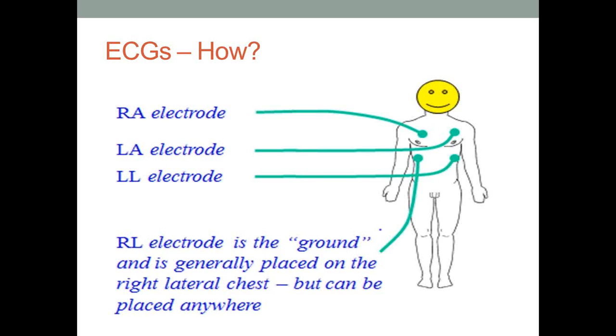So here's a little bit of the how behind recording an ECG. So typically, and you'll notice this hopefully on your cardiac monitors in the lab, you have 4 wires attached to the cardiac monitor, and each of them indicates where to put the probe, so where to put the actual electrode, the sticky part, on the patient. You'll see RA for right arm, LA for left arm, left lower, and right lower. So ideally you have them up near the clavicles of the patient and down near the lower abdomen of the patient on either side. There are some people who put them on the arms, the wrists, and the ankles. That's okay too. Either is fine. I like to put them on the core only because when you start moving the patient, you get them on a stair chair, you get them on the stretcher, the cables tend not to get in the way as much.